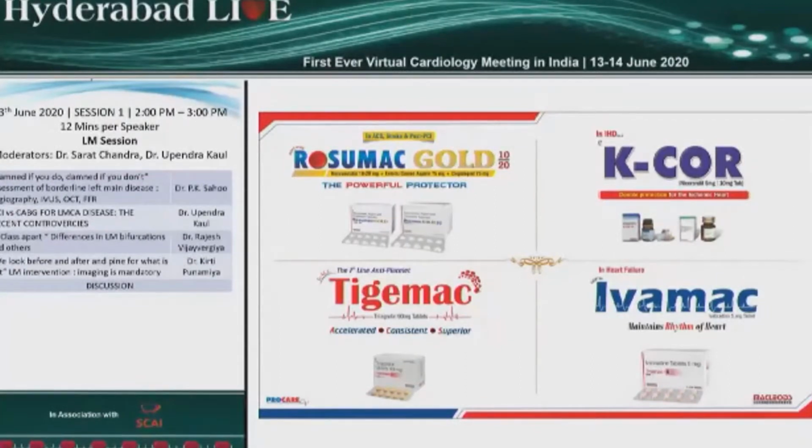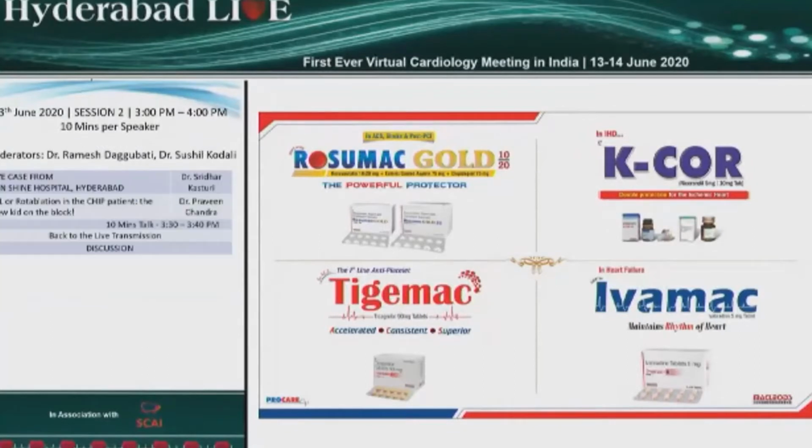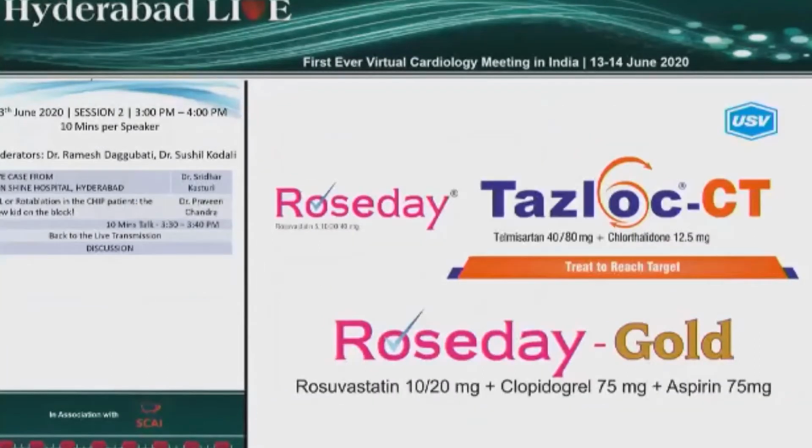And the first thing you do after you deploy the stent is a POT and establish complete apposition of the ostium and the proximal end of the stent, so that your guiding catheter will not further distort it. Apposed stents cannot be deformed. Malapposed stents can be deformed alone. And I think that is a rule, and one should remember that. Thank you, thank you very much, Kirti.